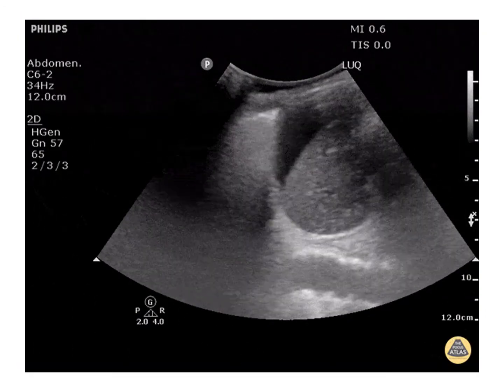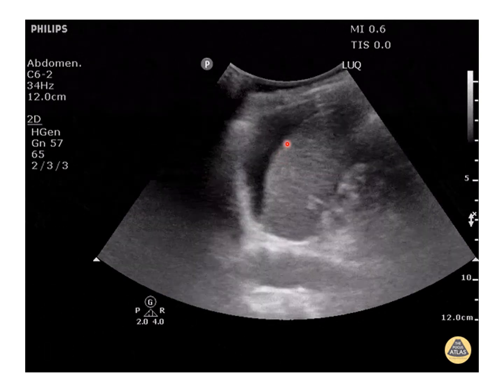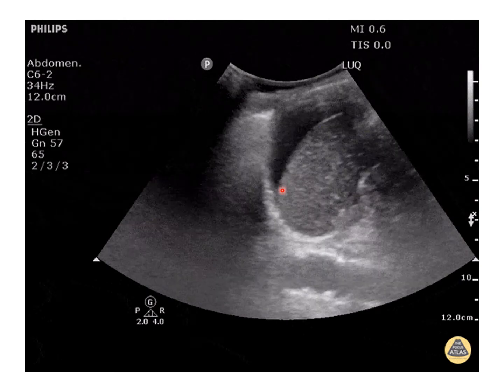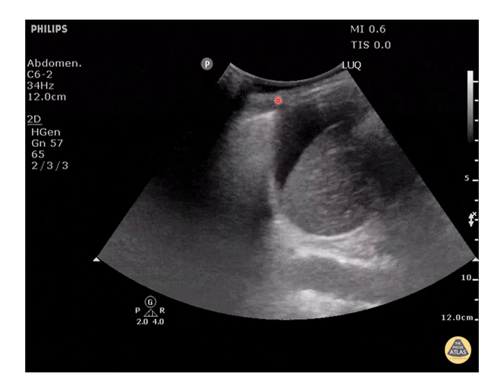There's a slightly more obvious one. Again, triangular, crescent-shaped black, which immediately catches your eye. This fluid is between the spleen and the diaphragm.